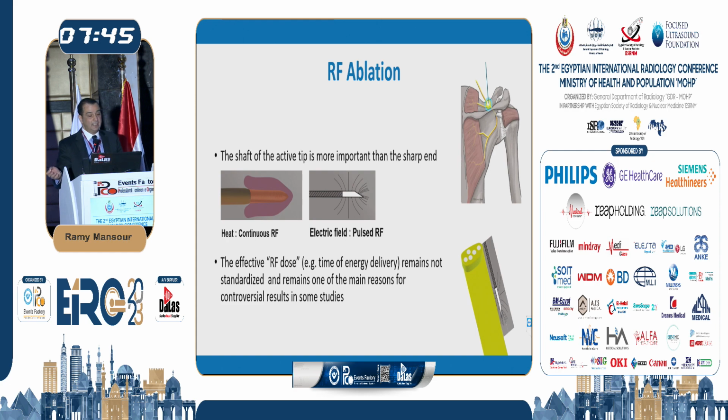So the tip of the needle, as you can see, is the active tip. The most important part is the shaft of the needle. As you can see here from the diagram, at the very tip of the tip, there is nothing there. So if you want to achieve a good ablation, your needle should be parallel to the nerve, not perpendicular, because the parallel is where the radiofrequency is. And the RF ablation dose remains not standardized for how long we need to apply the ablation.